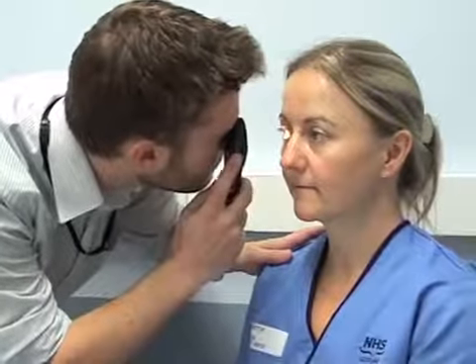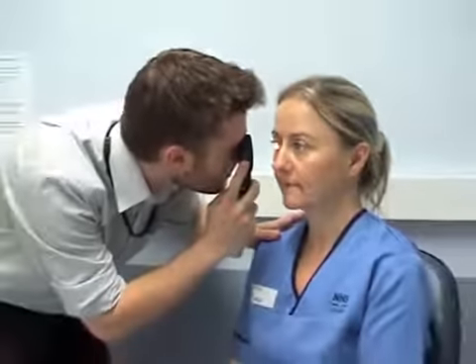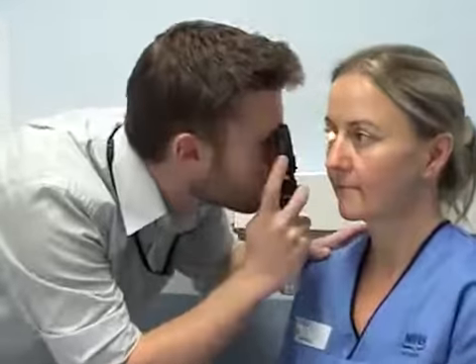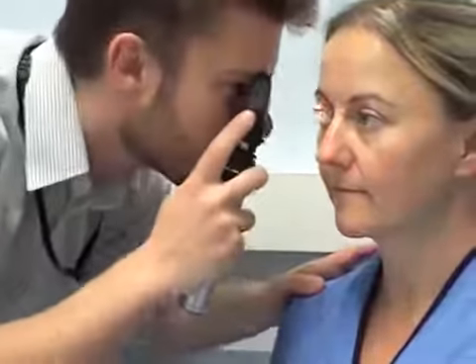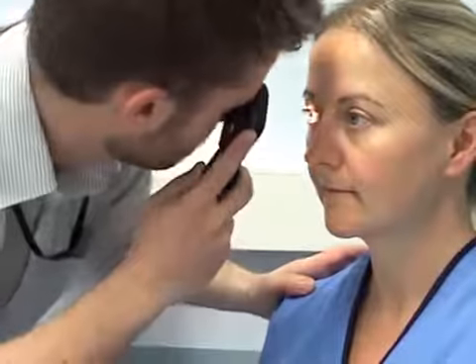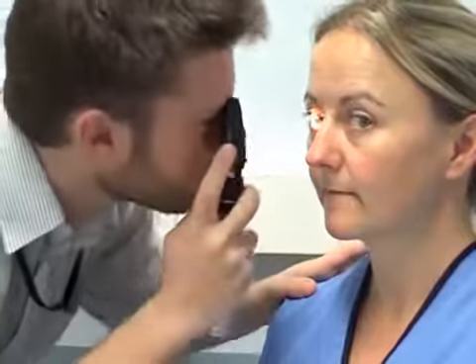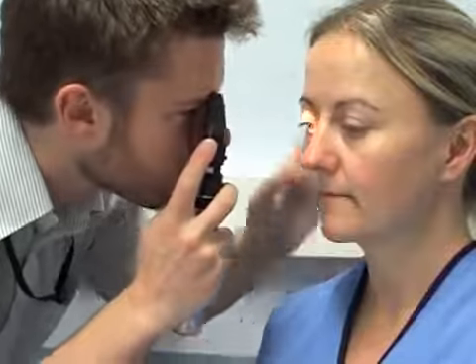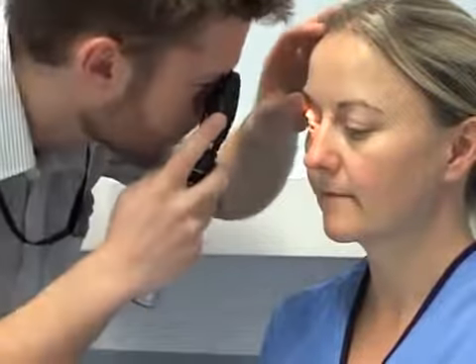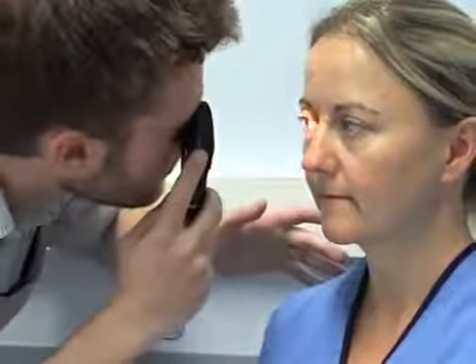Then dialing down from a 10 towards 0 shifts the point of focus from the front to the back of the eye, i.e. towards the retina, and this should be stopped when any retinal features such as blood vessels come into focus. The first structure usually encountered is the optic disc. Magnification is 15 times, so the disc usually fills an undilated view. If the disc is not seen immediately, any blood vessels should be followed, as this will lead to the optic disc, remembering that the V created by the branching vessels always points to the disc.